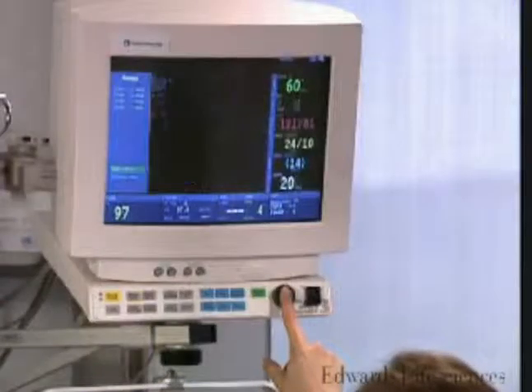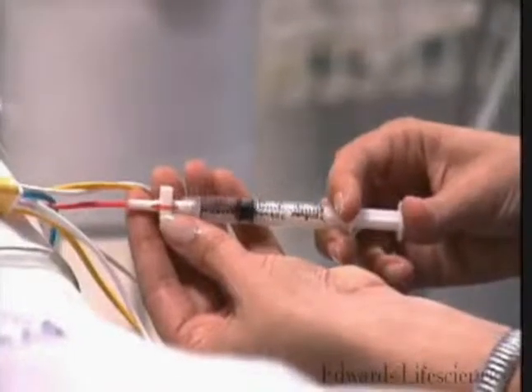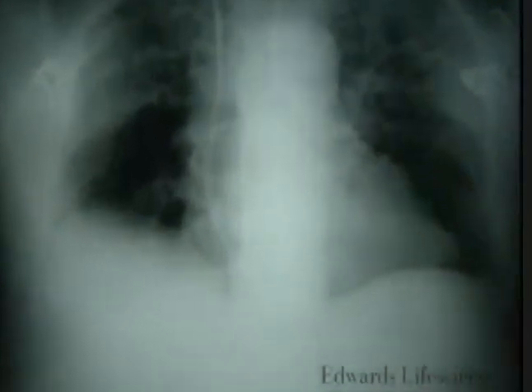One troubleshooting technique of pulmonary artery catheters involves assuring the proper position of the catheter. To determine correct positioning of the pulmonary artery catheter, the clinician must look at the centimeter markings on the catheter and must determine correct inflation and wedging of the catheter. This chest radiograph shows an appropriately positioned catheter.